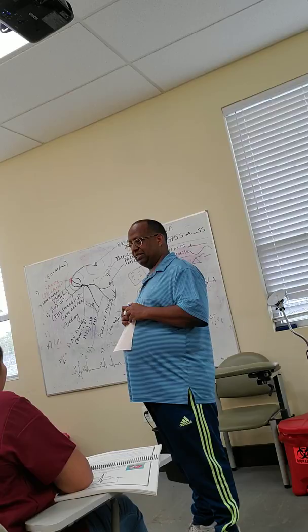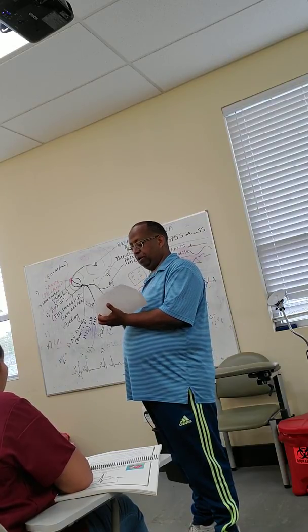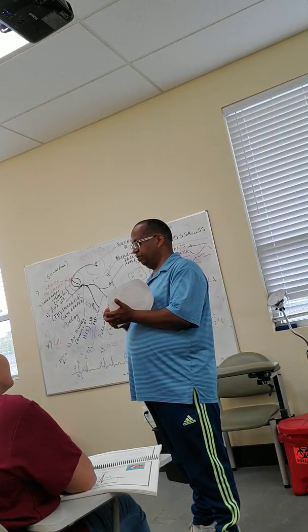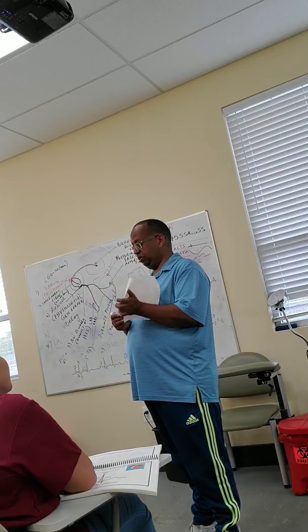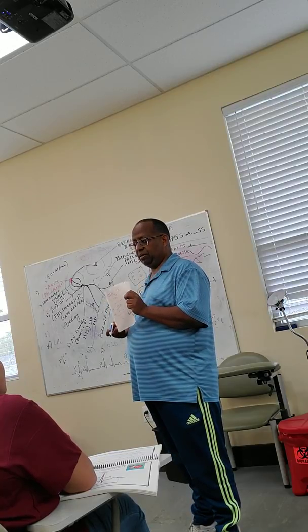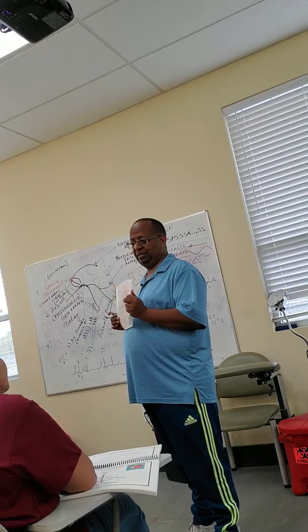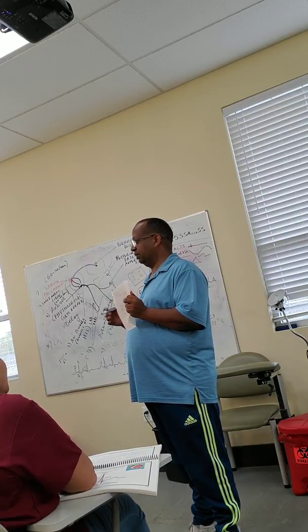Let's say you have 6 QRS complexes. You multiply 6 by 10, or if you are a lay person, just put a 0 after the 6, which makes 60. The heart rate will be 60. Let's say you have 7, what will be the heart rate? 70. 7 times 10 is 70.